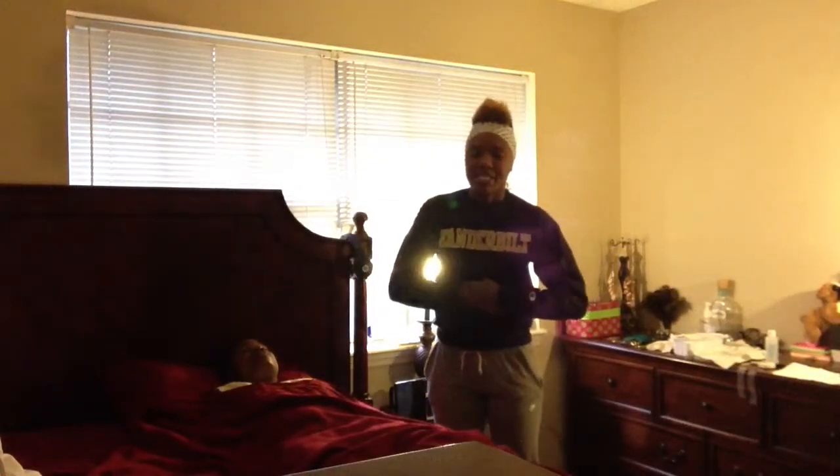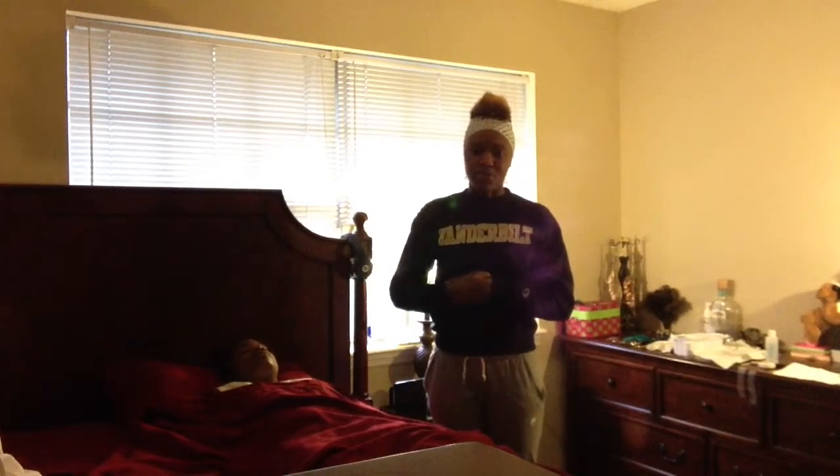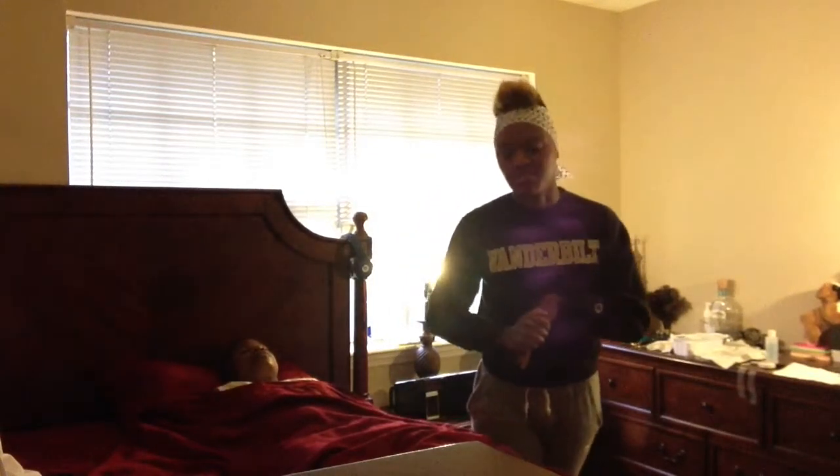My name is Patrice Littles, and today I will be inserting an NG tube. Before going into the patient's room, I want to check the doctor's orders. When I check the doctor's orders, I'm also going to check for consent because it's an invasive procedure.